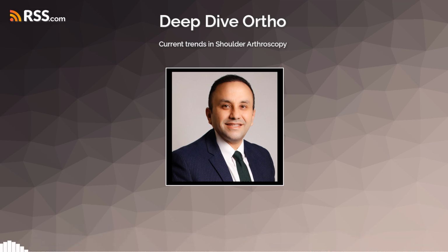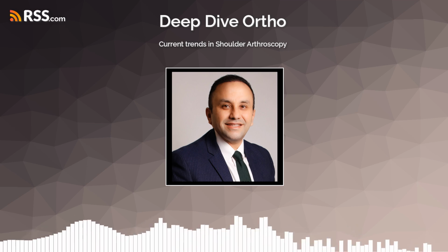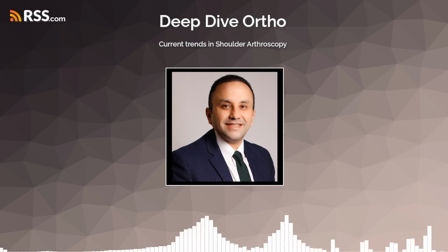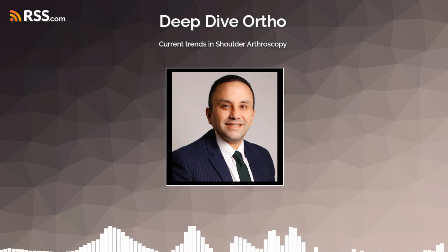Okay, so once we have a sense of the anatomy, how do we actually get a look inside a living shoulder? Radiological investigations are obviously crucial, and it sounds like good old x-rays are still the starting point. Absolutely. X-rays are fantastic for that initial overview, especially for identifying things like dislocations and fractures. Different views let us see the bones from various angles, which is key for diagnosing specific problems.